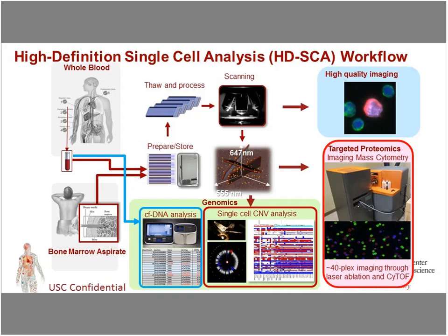So the blue line and the box here show the new addition of the Ion Torrent Oncomine Cell-Free Research Assay for evaluation of cfDNA, as an expansion of our existing workflow. The integration of genomic analysis and assessment of analytic variables in single-cell CTCs and cfDNA, added to the protein markers measured in CTCs, ensures we have a more comprehensive understanding of the patients.